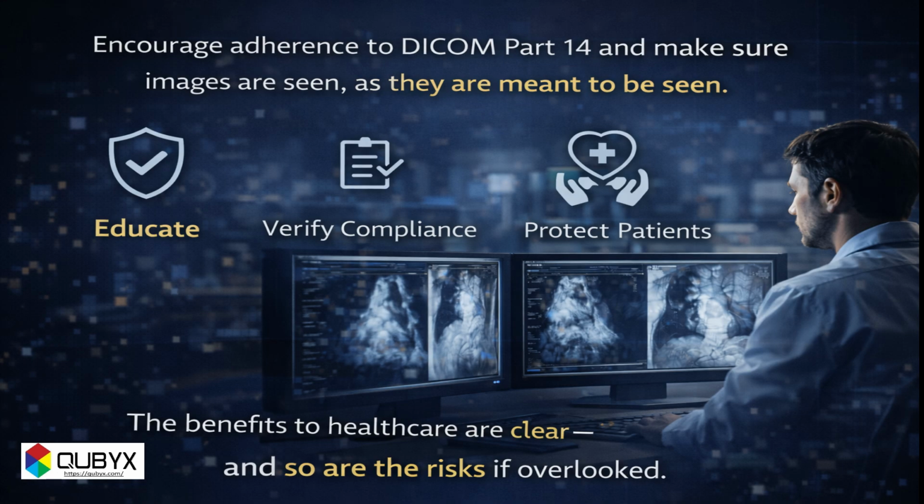Remote radiology does not eliminate the need for standards. It amplifies it. DICOM Part 14 ensures that radiologists see what they are meant to see, regardless of location. Because when grayscale accuracy is not standardized, diagnostic consistency cannot be guaranteed.